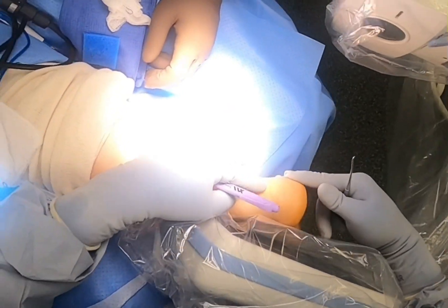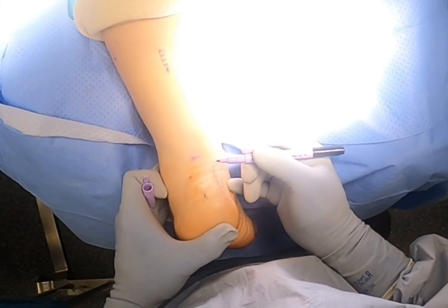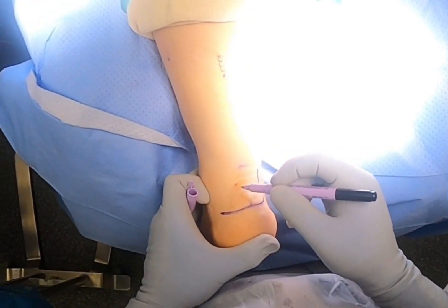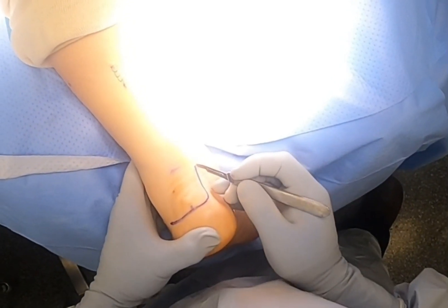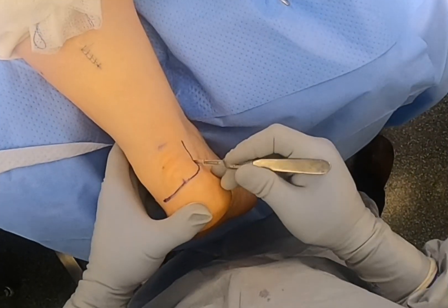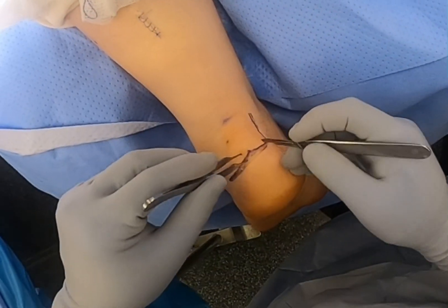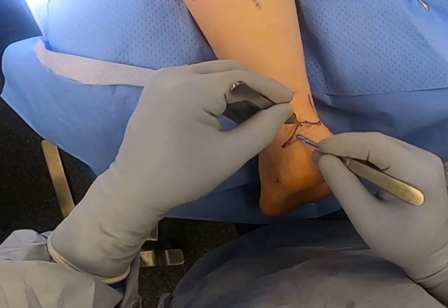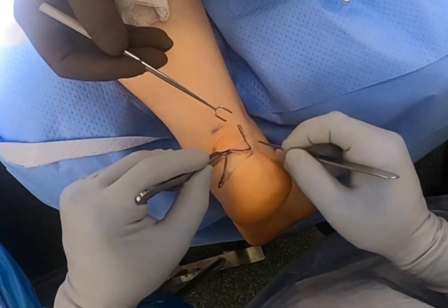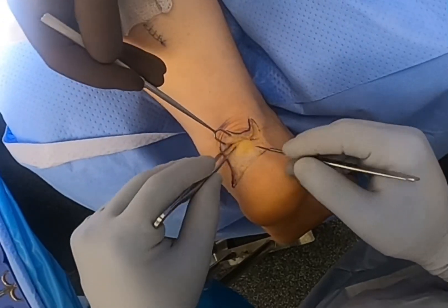At this time, I'm going with the Ziscan intraoperative fluoroscopy to mark where the actual spur is. I make a lazy L-incision from superomedial to inferolateral, full thickness flap to spare blood supply in this area, as it is quite tenuous. Meticulous dissection is imperative in this area for that particular reason. Once I have this flap somewhat opened, there is a plane that you go under, and you can pretty much release that in a full thickness flap.